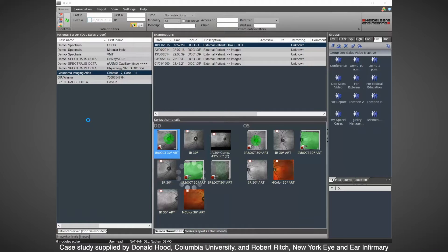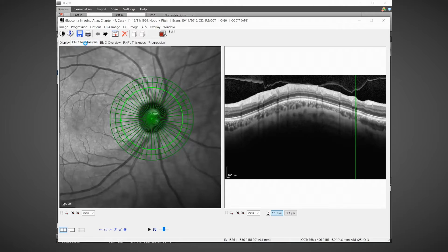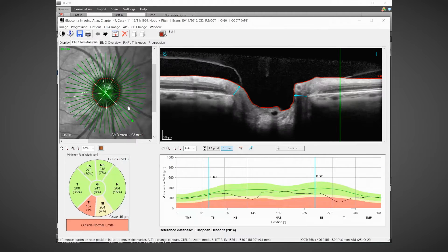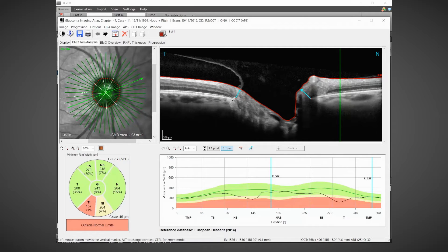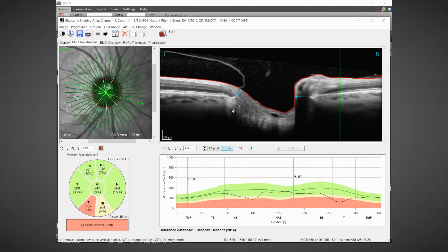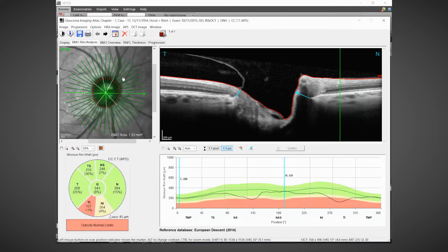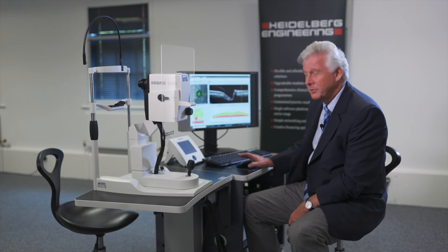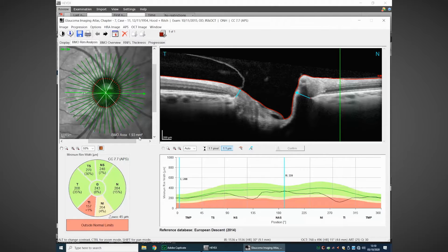Looking at the OCT, we first examine the neuroretinal rim. We've identified 48 locations of Bruch's membrane opening and can measure from Bruch's membrane opening — the true anatomic disc margin — to the inner limiting membrane, giving us the minimum rim tissue all the way around the optic nerve. From these 48 locations we also identify the disc size; in this case the patient has a disc size of 1.93 mm², which we'd consider fairly average, so the neuroretinal rim profile should follow pretty much the green line in the middle of the normative range.